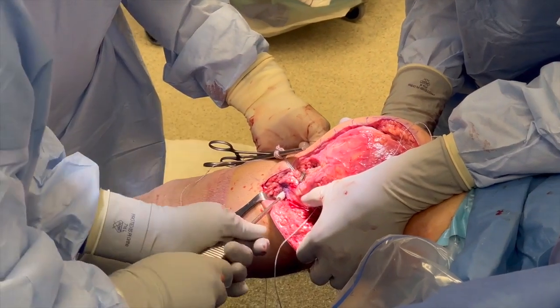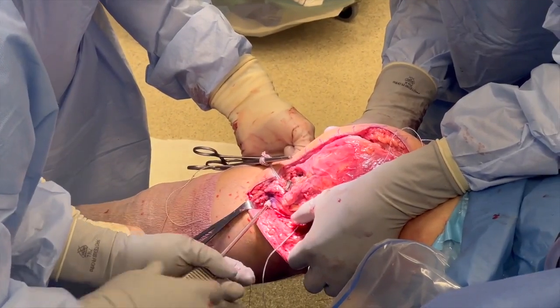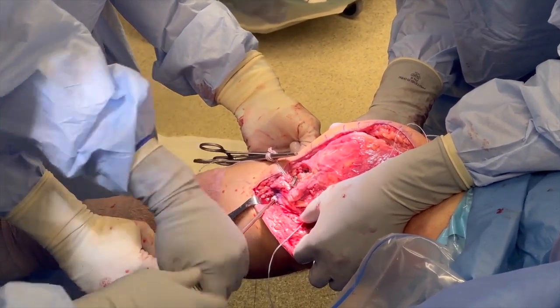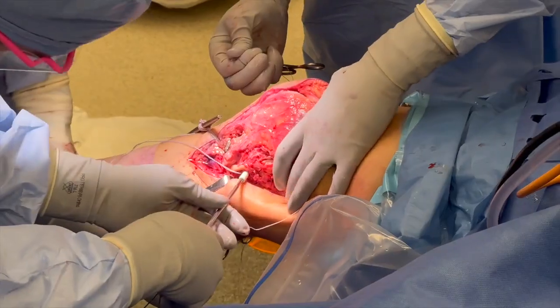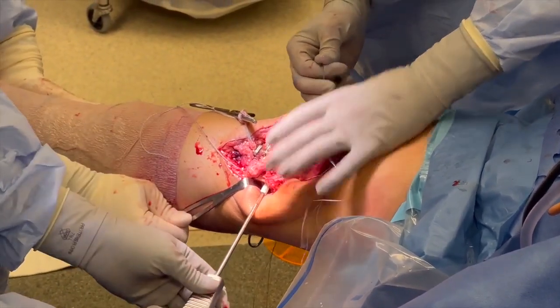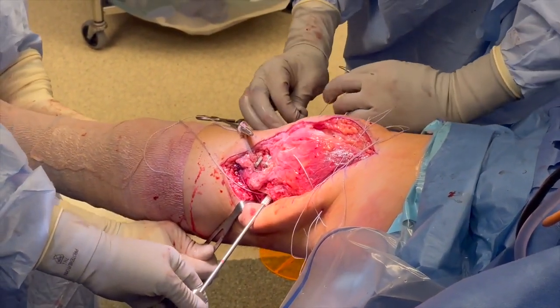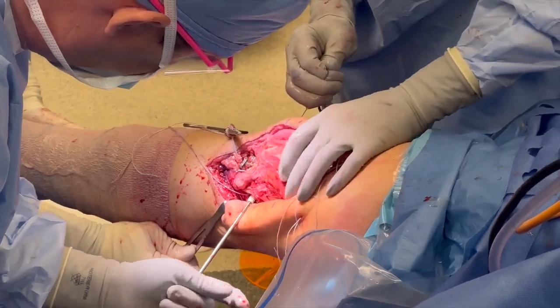The MCL graft is fixed first in the tibia with the knee at 30 degrees of flexion with a slight varus reduction force and the knee in neutral rotation. A 7 by 20 mm bioabsorbable screw is used for fixation distal to the graft at the previously notched position in the tibial tunnel. The POL is fixated with the knee in extension with a 7 by 20 mm bioabsorbable screw. This final fixation eliminated the patient's valgus gapping and anteromedial rotation.